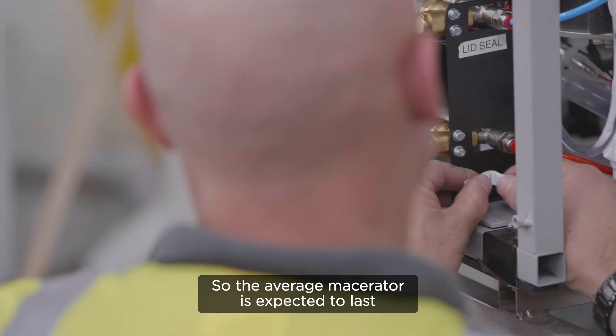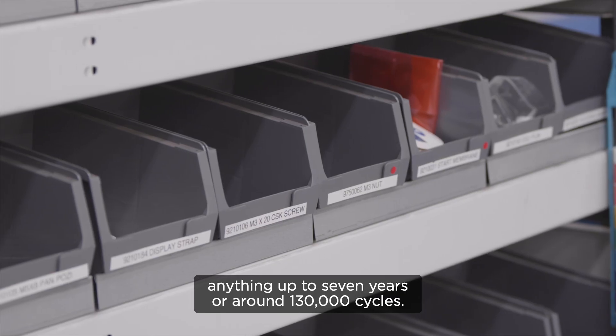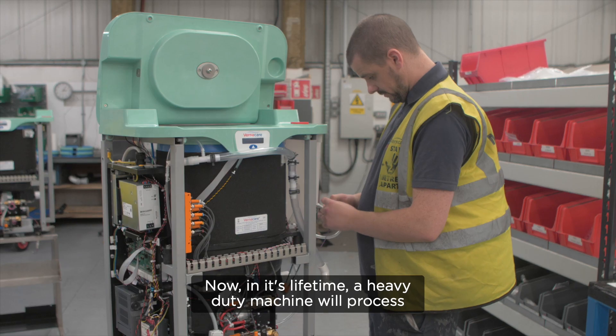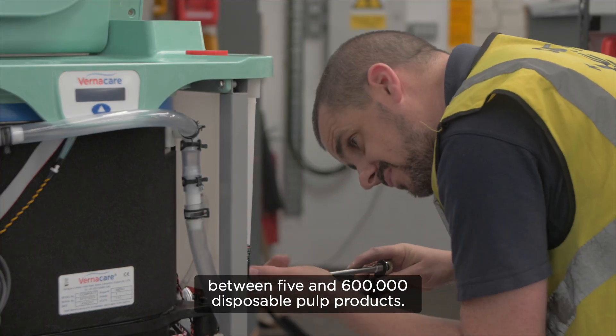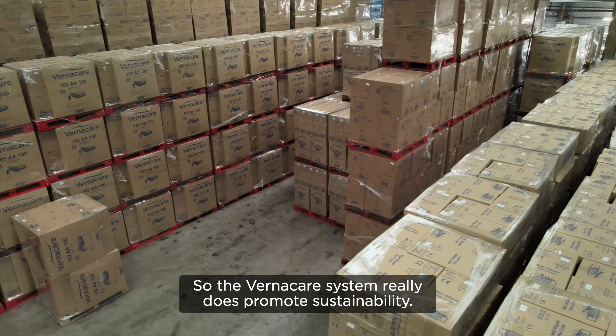The average macerator is expected to last anything up to seven years or around 130,000 cycles. In its lifetime, a heavy duty machine will process between five and six hundred thousand disposable pulp products. So the Vernacare system really does promote sustainability.